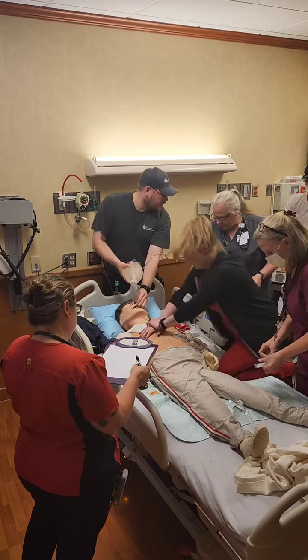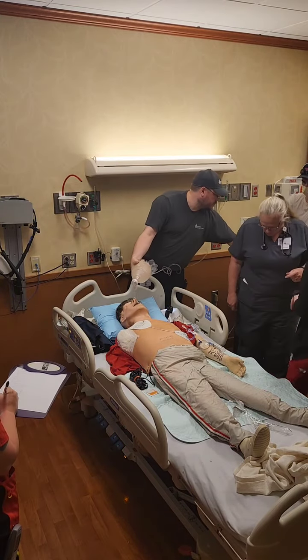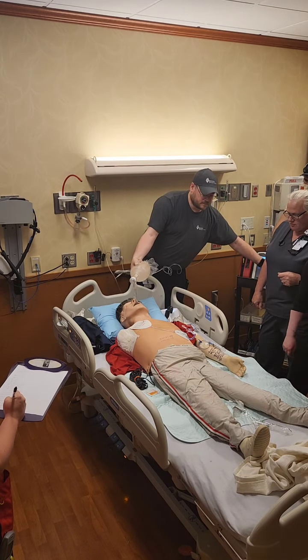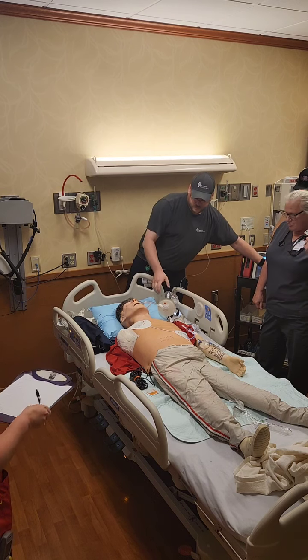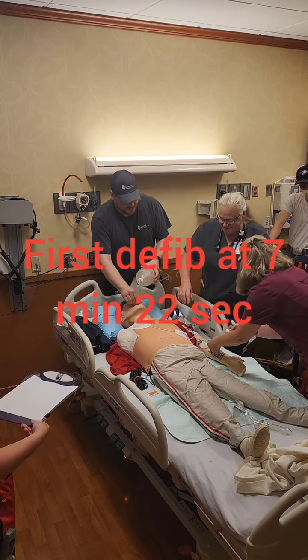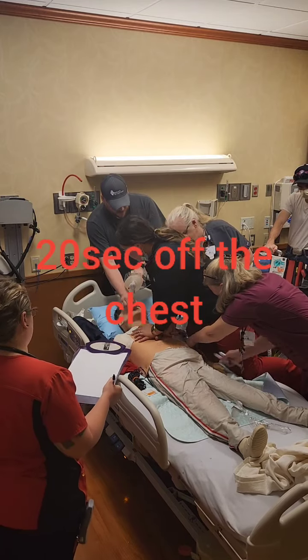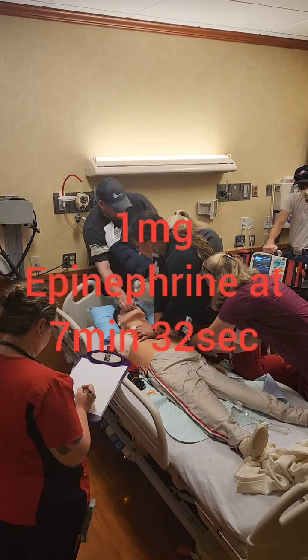2 minutes. Clear. Okay, we're going to shock. Doing a shock at 150. Charge. Somebody want to come in? Everybody clear? Somebody else get in there just for practice. Okay. Everyone clear? Clear. Shock delivered. Start. Somebody get back on the chest. Go ahead. Okay, one dose of Epi is in.